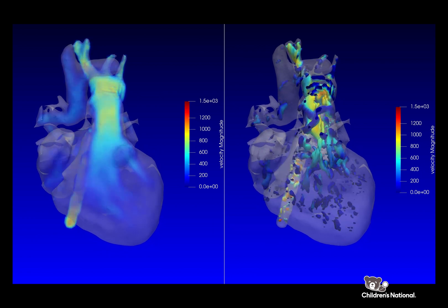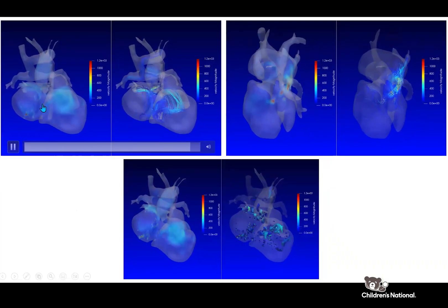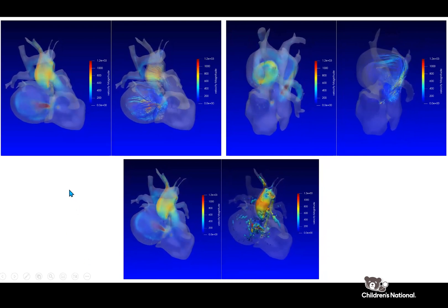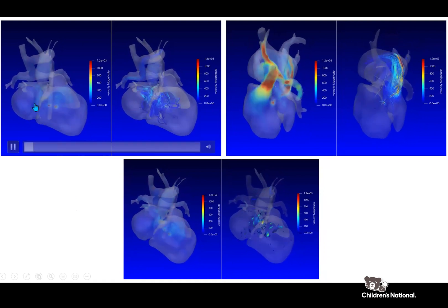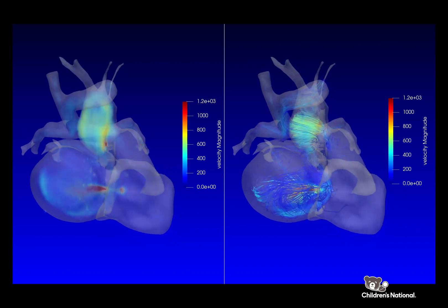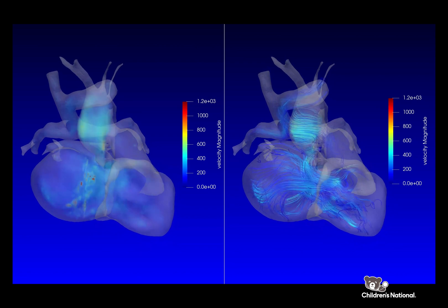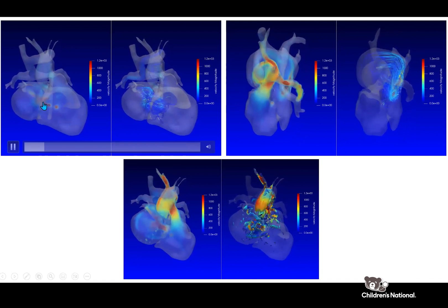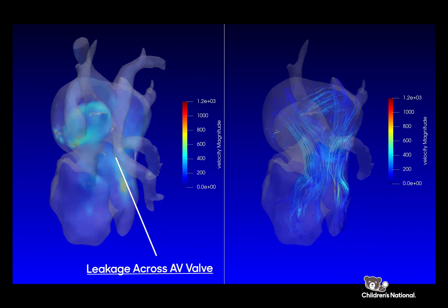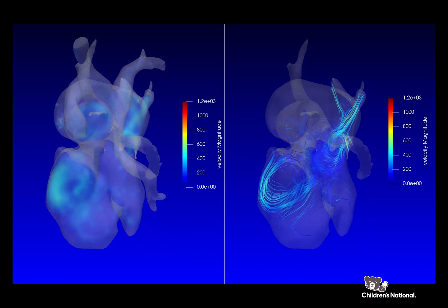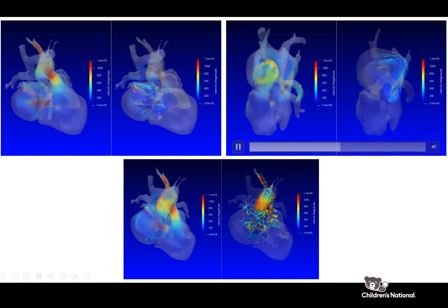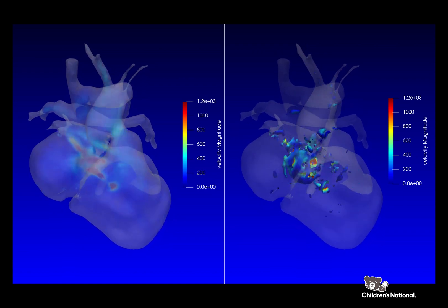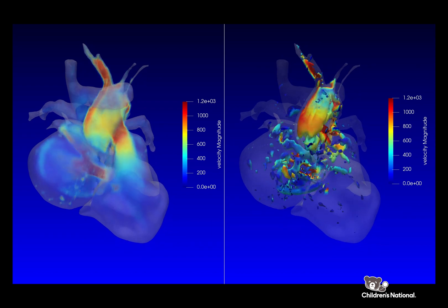How does this look when the heart is unhealthy? This is an unhealthy single ventricle patient with a condition known as atrial ventricular valve regurgitation, or leakage of the common valve that separates the atrium and the ventricle. You can see from the blood flow here that when the heart squeezes, there is a jet of leakage that shoots back into the atrium, represented by the streamlines here as well as from another perspective. This seems to result in significant changes in the blood flowing in the atrium. In fact, even on the model itself, you can see that the atrium is a lot larger than what we would expect, and the contours show significant alteration of the way blood flows in the atrium when the heart squeezes.